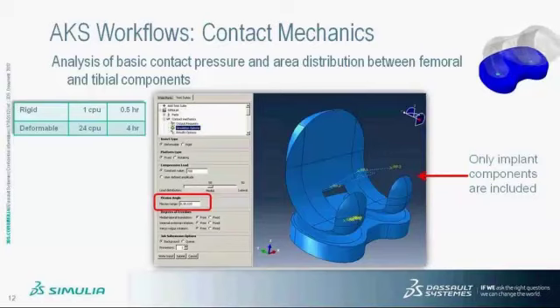During the analysis, the femur component is flexed to a certain flexion angle specified by the user. Here is where the user specifies how much flexion the femur component should go through. The first value is the beginning flexion angle, and the last value is the end flexion angle. The number in the middle is the increment at which the Abaqus knee simulator will provide output to the user.